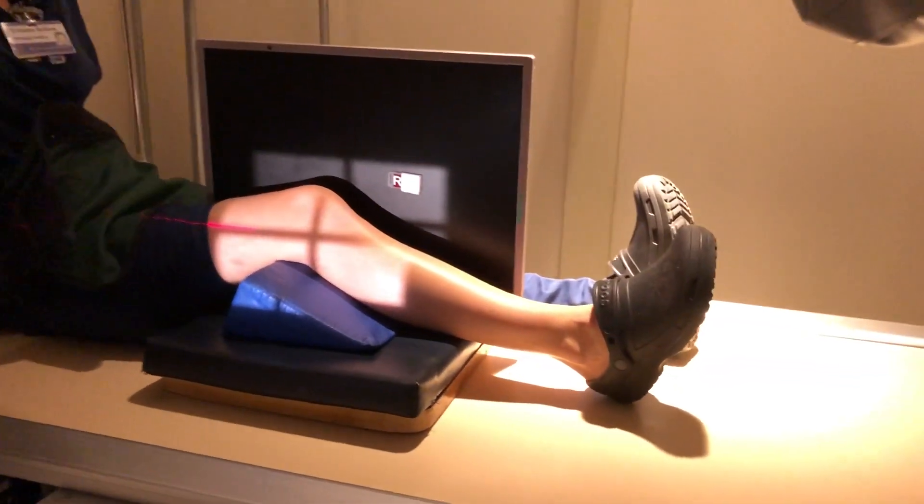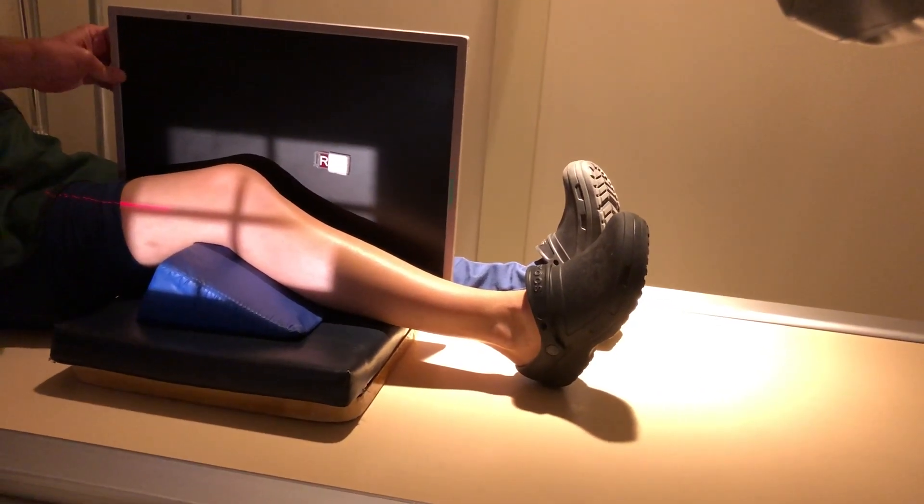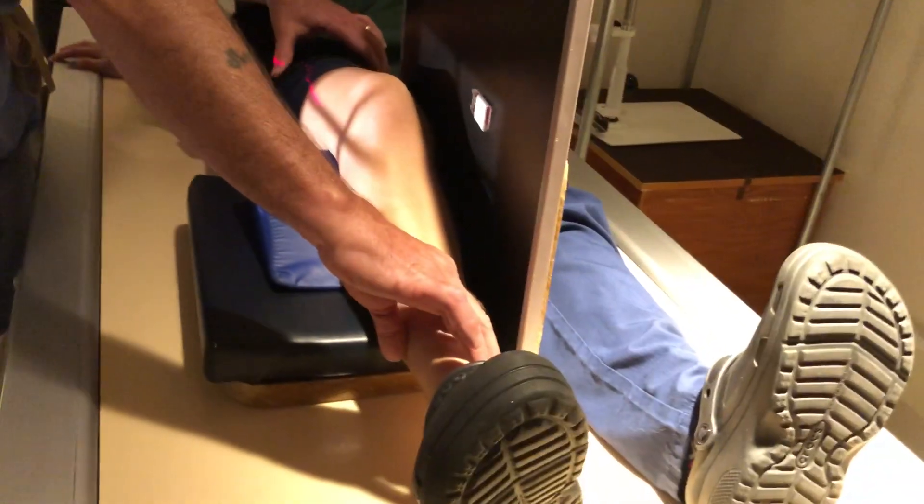It's always a cross-table lateral. What you really want to do is make sure that you have from the hip to the ankle all in the same line, and feel for these condyles and make sure they're perpendicular to the IR. It's a little tricky to do because if you don't have everything perfect, it's not going to come out right.